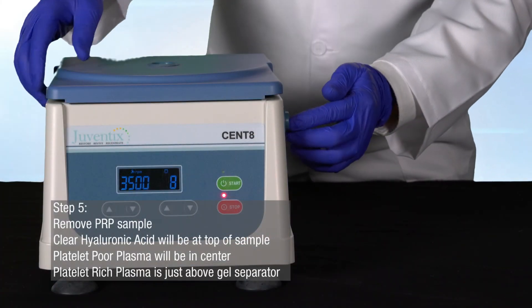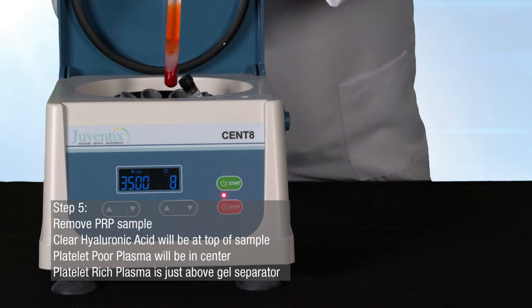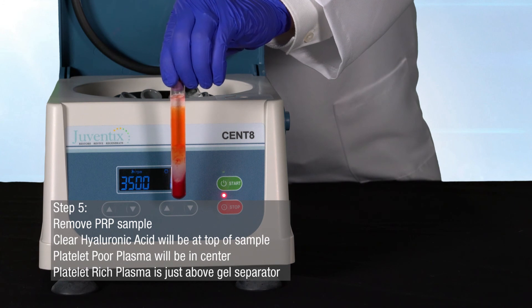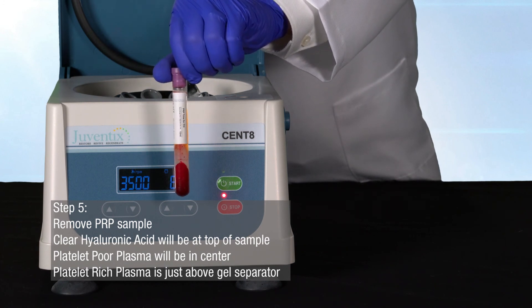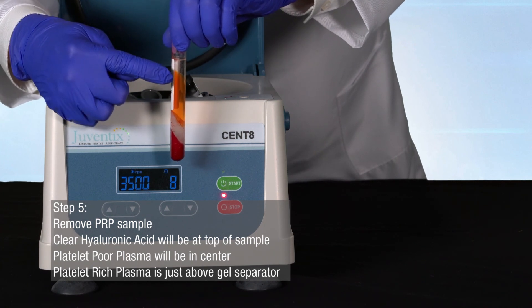Once centrifuging is complete, remove your blood sample. The blood sample will now show distinct layers. The clear hyaluronic acid will now be at the top of the sample, followed by platelet-poor plasma and platelet-rich plasma just above the gel separator.